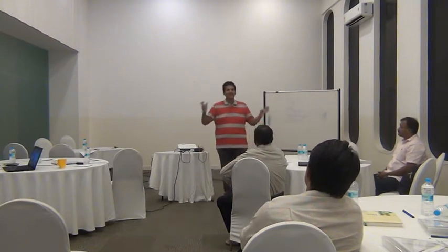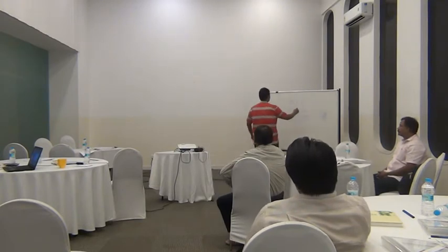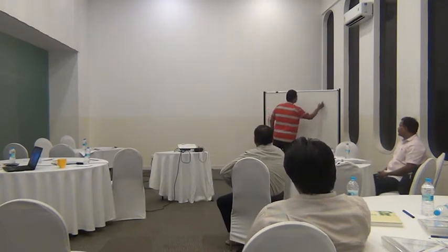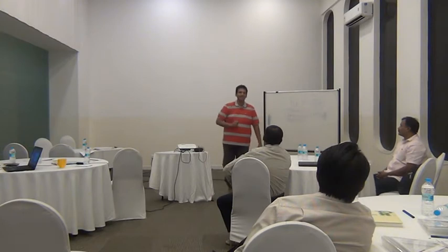What happens is a question. What is concerned here is, we all know that the human body is composed of 70% water. A larger content of our body is water. Of that water, what is fundamentally water is H2O. And the fundamental thing is you have a large amount of hydrogen present in the body. Hydrogen contains one proton. It's a positively charged proton.